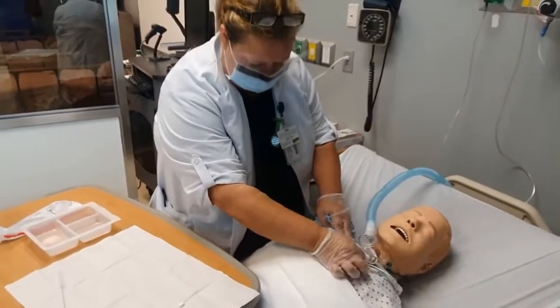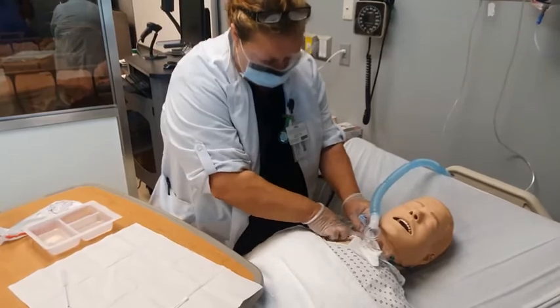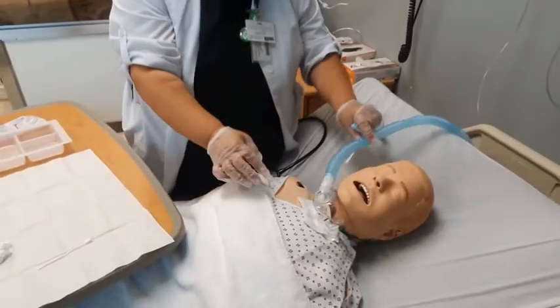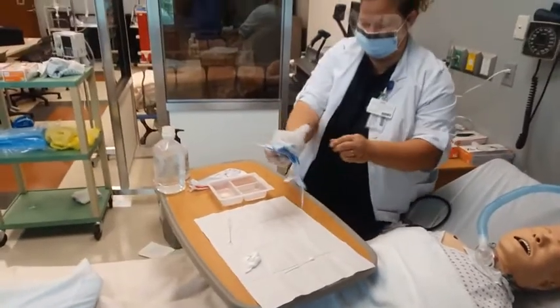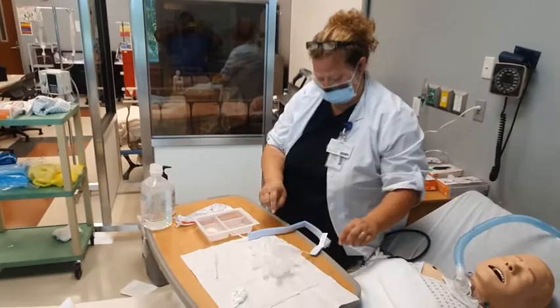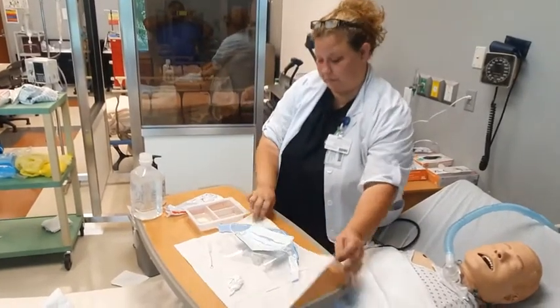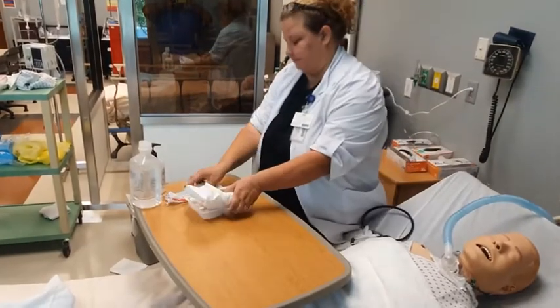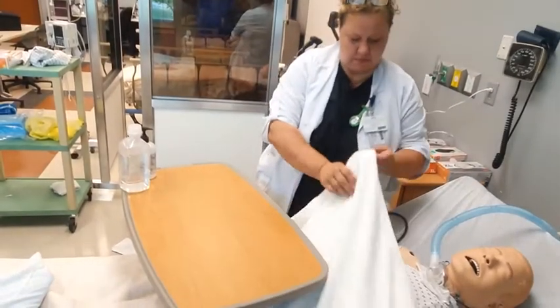If this did happen with your gauze, you're still not having to be sterile, and you can slide it back under there. Go ahead and discard all your disposable equipment appropriately. Remove your gloves and your mask and face shield. Clean your hands. Reassess their respiratory status.